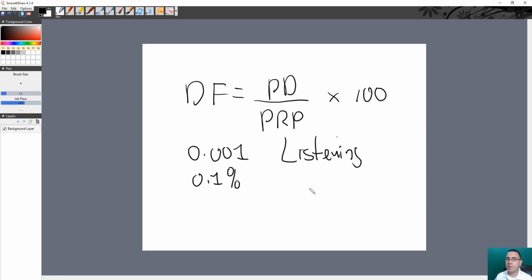That means that most of the time your machine is listening. Most of the time your machine is listening, and it's kind of a lazy system. The on time is pretty short. It's not lazy at all. It works a lot. But it's just a nice way to remember when you're studying all of this.